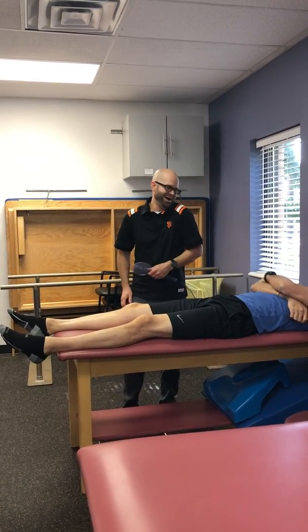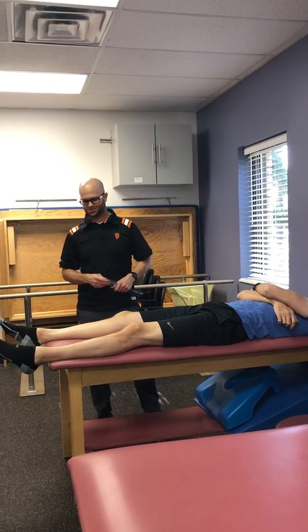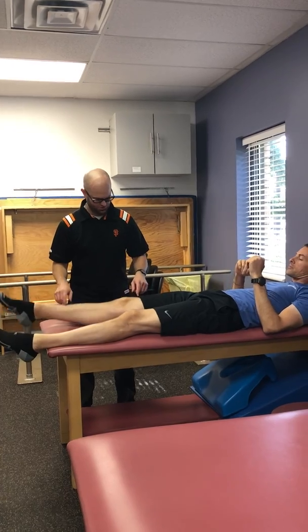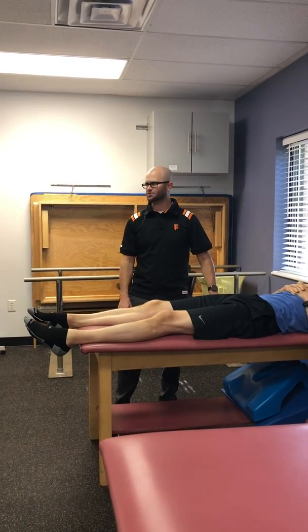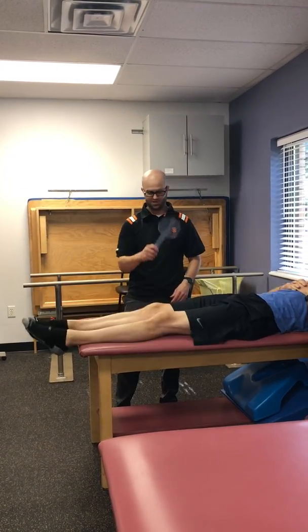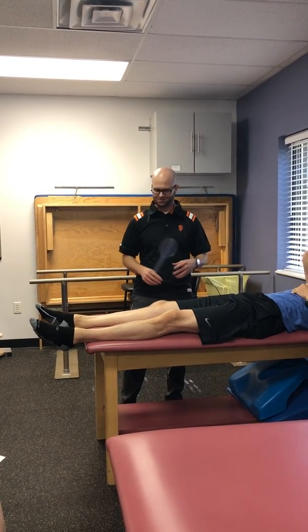Oh, thank you. Okay. Now we want to do ADduction. If we want to do ADduction, I want you to actively adduct or pull your leg. There we go. Okay. What did he have to do there? Lift it. You have to lift his leg over that one. We're getting a lot of other muscles that we don't want to worry about.